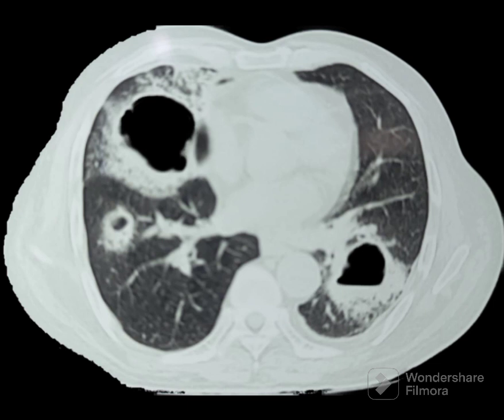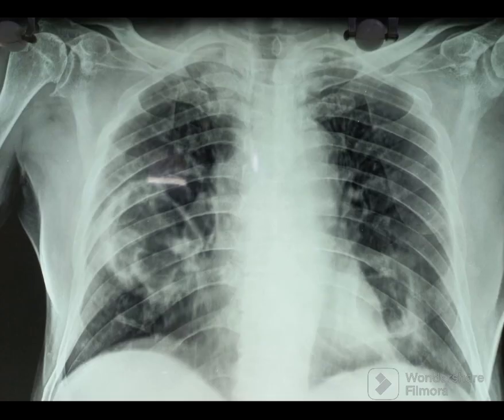Generally, the wall should be five millimeters thick or more to call it a cavity. If it is four millimeters or less, it is considered a cyst. Cavity lesions in the lung could be caused by a variety of causes.